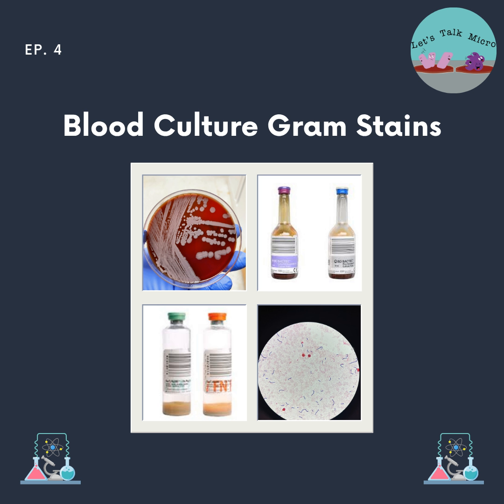There's something else that you have to do with blood cultures. Blood cultures are considered critical values in the lab. This means that these are significant results that you have to call to the provider as soon as you get them. Can you think of another lab test that is a critical value? Well, if you're thinking CSF, or cerebrospinal fluid, you are right, because you shouldn't have any organisms there, and that's definitely critical. And when you have a critical value, there's a specific format that you have to use.